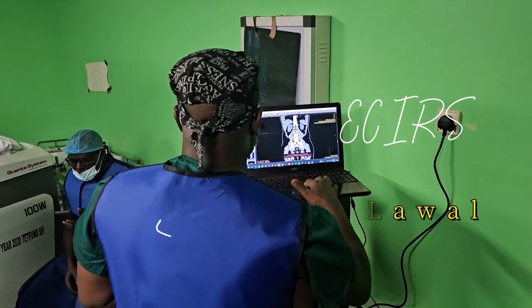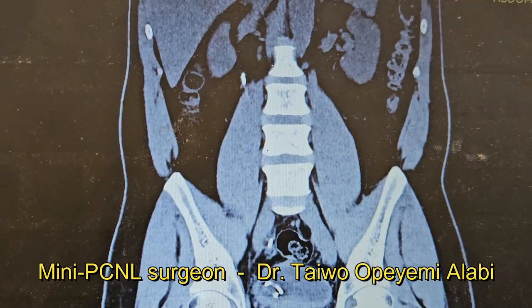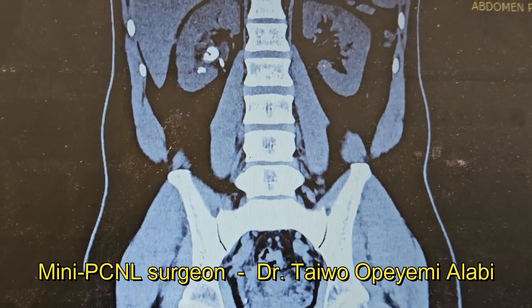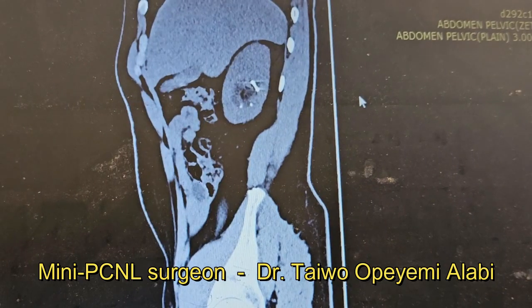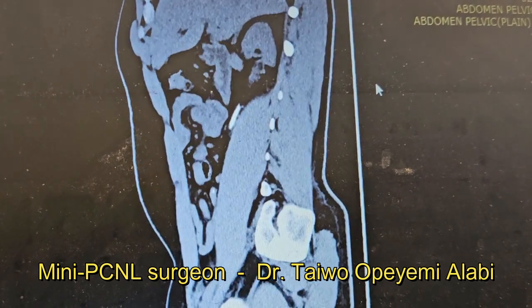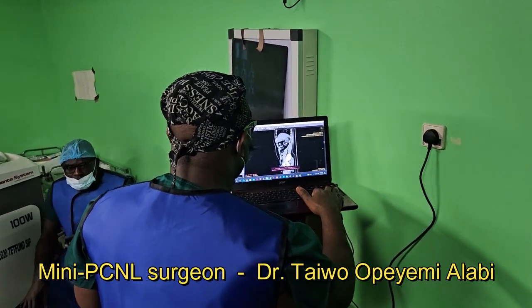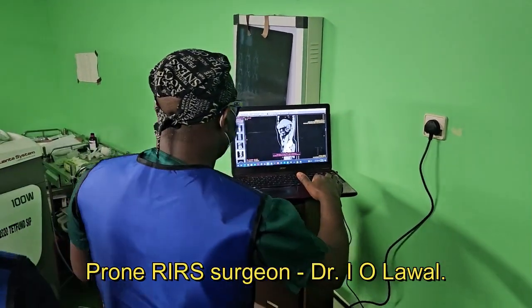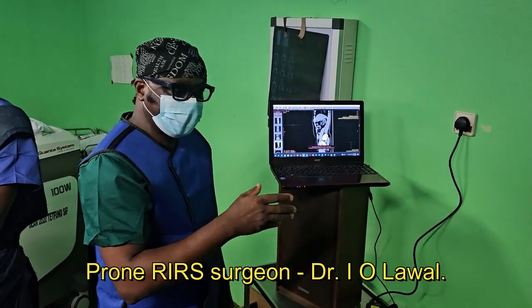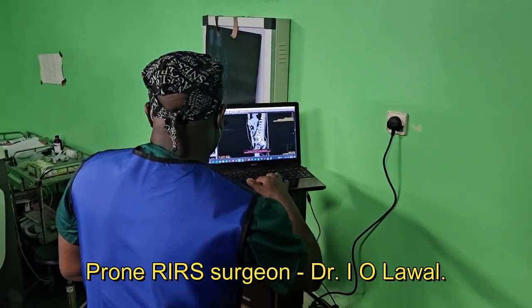We also have the sagittal view, and you are looking for possible retrorenal colon, it must be emphasized. If you have a retrorenal colon, that can be a danger sign. You can easily puncture it and you can have fecal fistula and all of that. So you need to do that. Then you come to the axial view too.